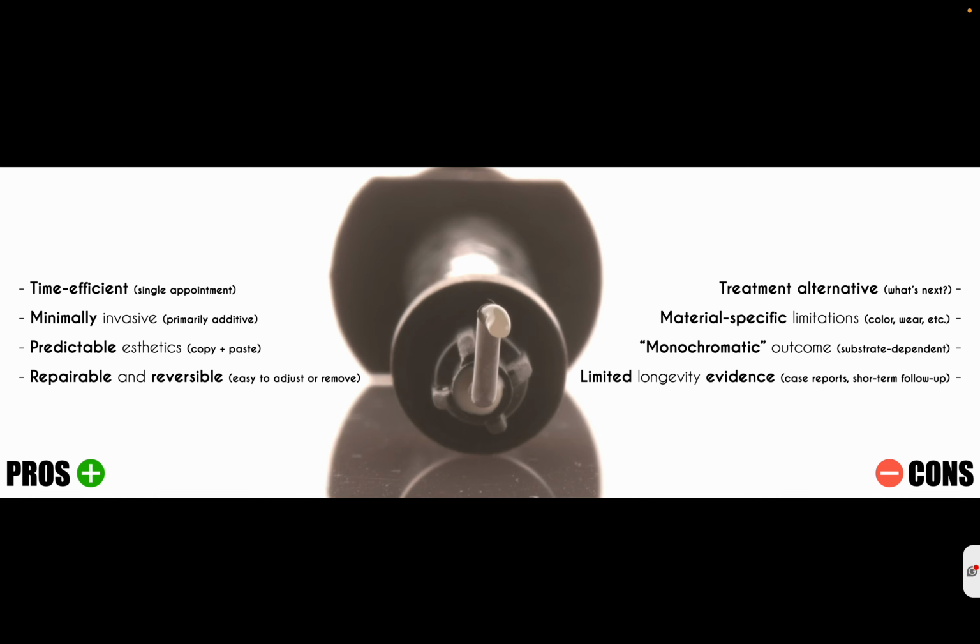Which are the pros of this technique? It's time efficient because it's a single appointment. Normally you can manage these cases in one appointment. It's minimally invasive. Why? Because we are trying to add, and due to the material being flowable and resin, we don't need to prep most of the cases, we need just to add. Then it's predictable, yes it is. Why? Because we copy and paste the mock-up that we already tried on the patient before. And also, because it's resin, it's reparable and reversible. What does it mean? I didn't touch the teeth, and if something happens, I can repeat or I can repair.